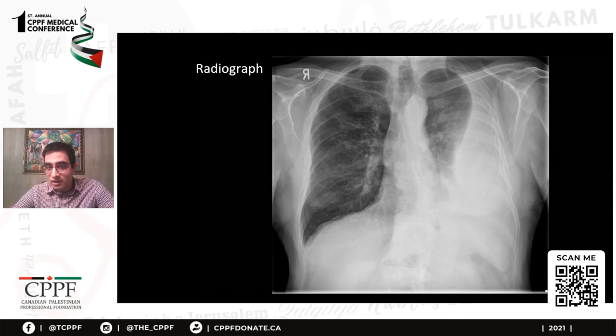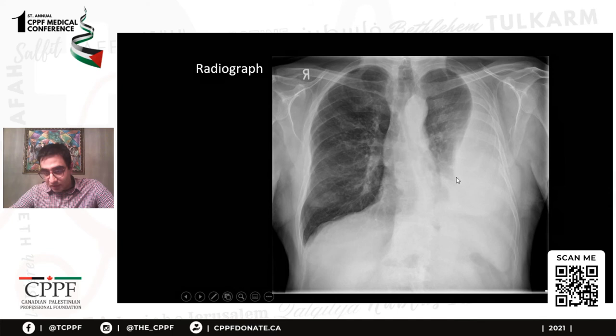All right, notice the shape of this. So if this patient's upright, which this patient is upright, we're seeing the fluid go up all the way to the pulmonary apex, and it forms almost like a ball-like figure here, and then the curve goes linearly. It's not typical for what a pleural effusion should look like. So let's do the next question.